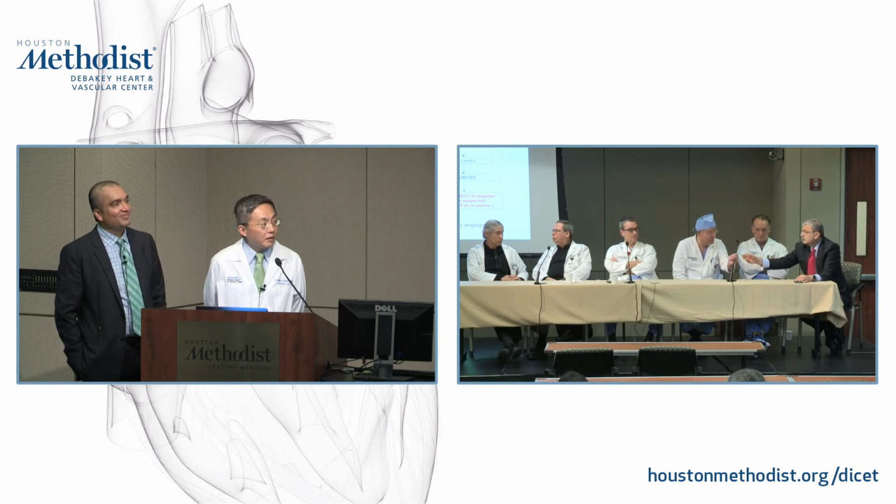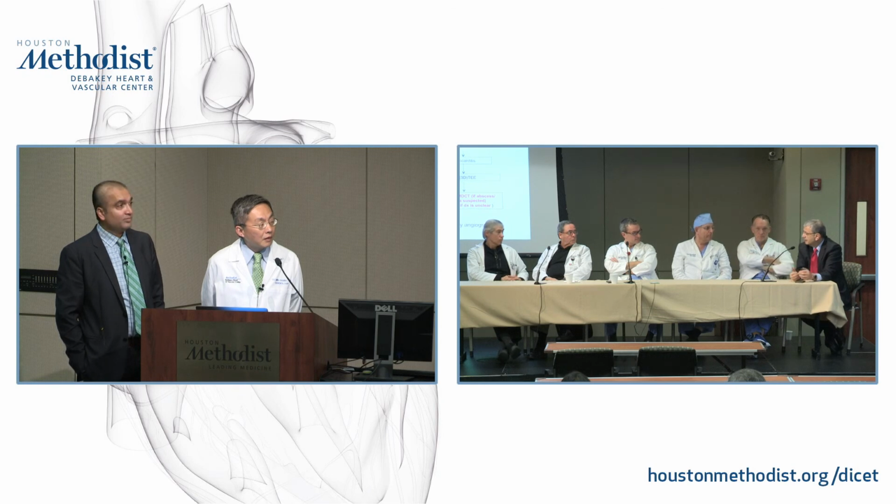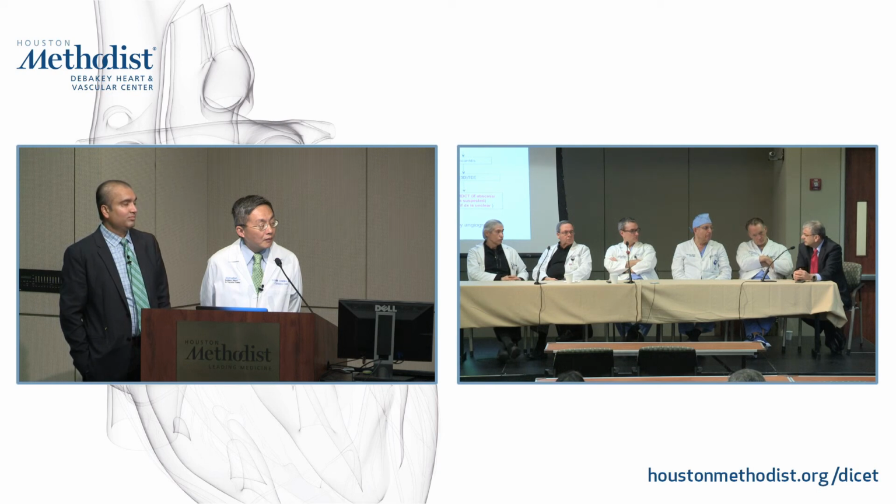I would say transesophageal or CT would be the ones to look at a bioprosthesis, whether there is early thickening as opposed to thrombus, and there are some larger thrombi. You want high spatial and temporal resolution for this, and I think TEE and CT at this stage are probably the best from a structural point of view.